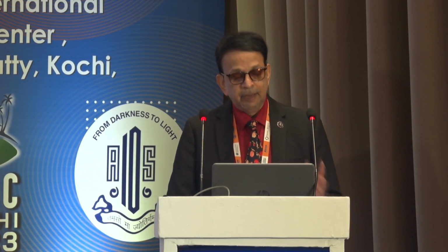The advantage of the Malyugin ring is that the pupil size is maintained very well, and the pupil anatomy is maintained very well. Even in a multifocal lens, you can go to it, whereas sometimes iris hooks can damage, you can have sphincter damage. You can see the pupil is exactly round. Or you can put a BX ring, which works very well as well. The only thing is, I find the BX ring is a little fragile.